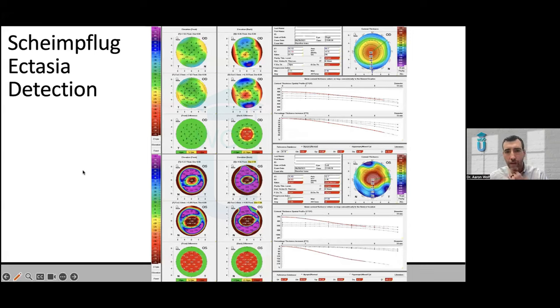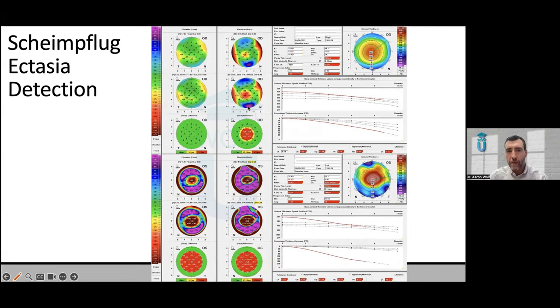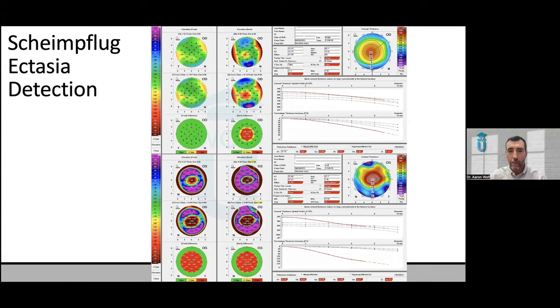The software shows the front of the cornea on the left and the back on the right, with analytics that essentially assess how the cornea thins from the middle and thickens going outward, and how regular that rate is. With keratoconus, it will be really thin in a certain spot, and the rate at which it thickens back to normal tissue is quicker — showing up on your images. This illustrates very mild keratoconus on top and more severe keratoconus on the bottom.